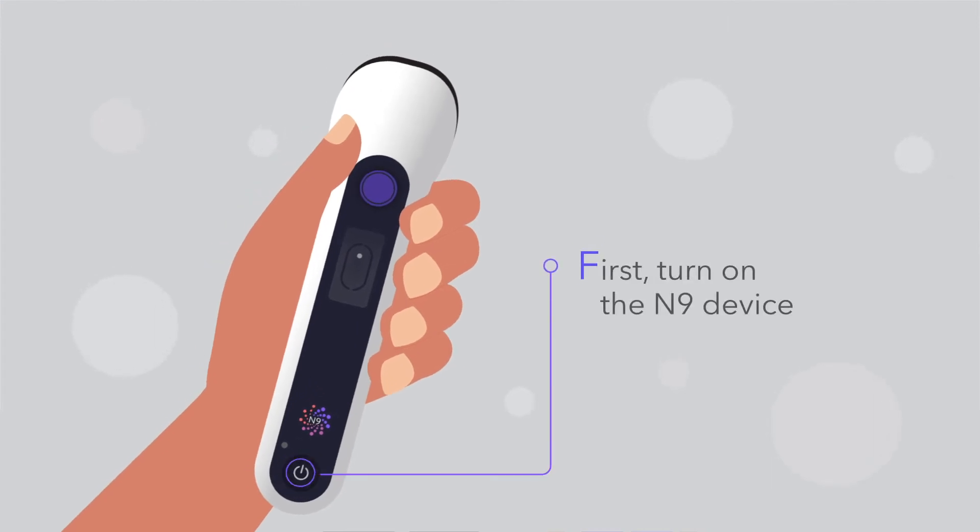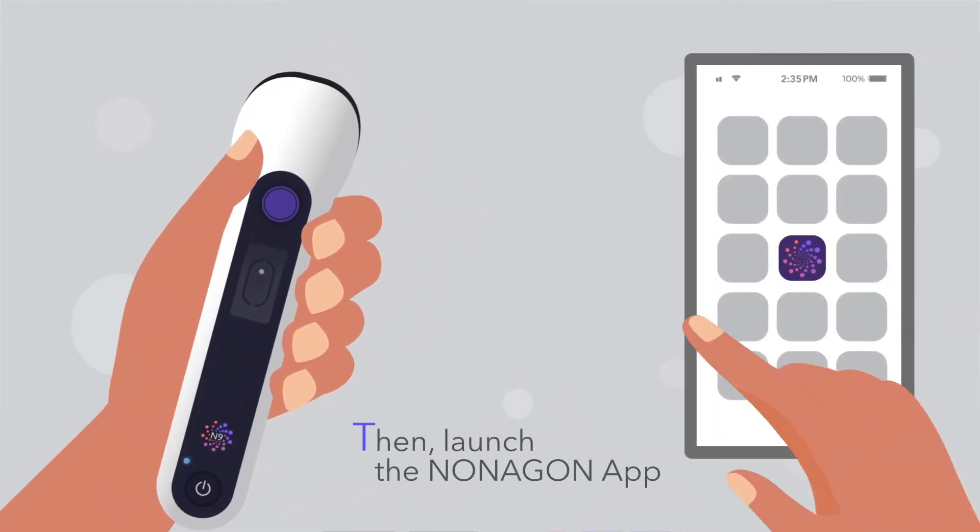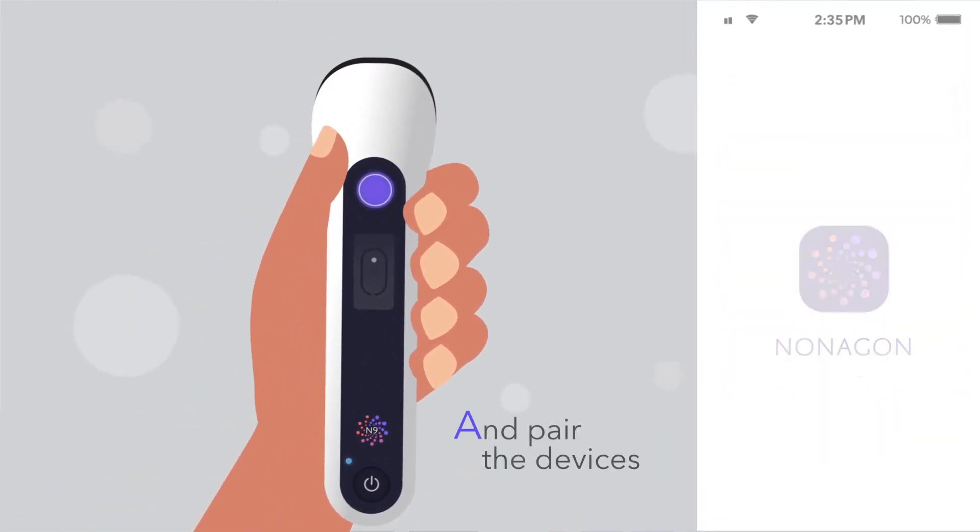First, turn on your N9 device. Then, launch the Nonagon app and pair the devices.